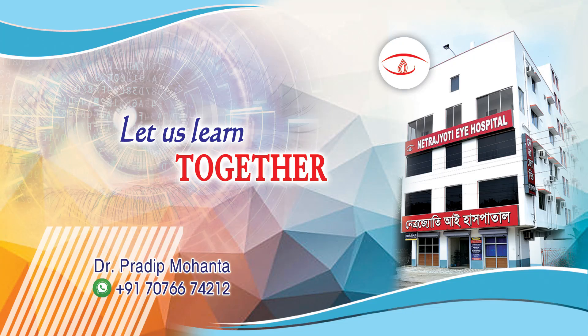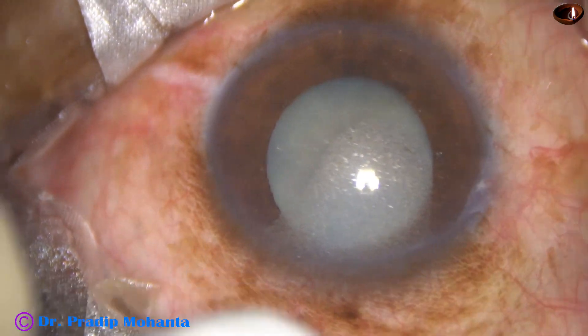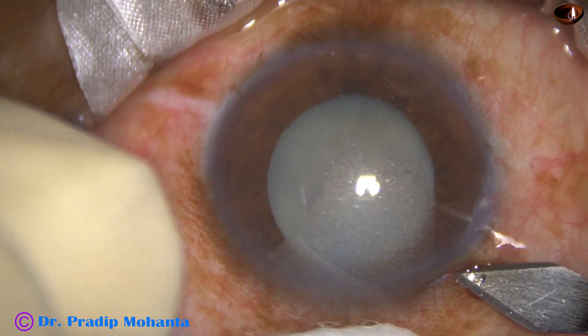Friends, welcome to my workplace at Ranaghat, West Bengal, India. This is a silicon oil filled eye with mature cataract. We can see silicon particles in the anterior chamber sticking to the cornea. Let us observe this surgery.